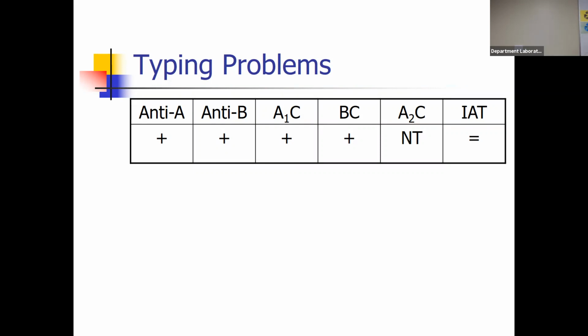So what you have to think about is negative IAT, so it's not an autoantibody, not something in my patient plasma. So these results are probably correct, right? So it's not affecting my patient plasma, it's in your front type, all right? So what could cause a pan-reactivity in your front type?